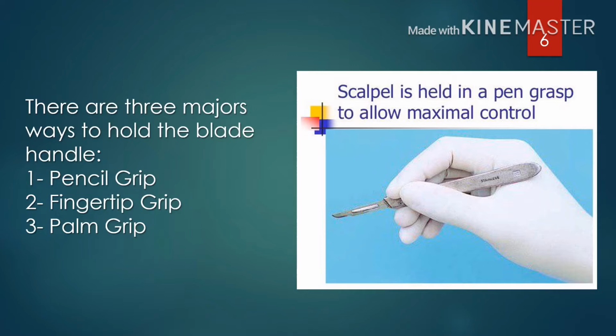There are 3 major ways to hold a scalpel. The first and most important one is the pencil grip, which most dentists use because it allows maximal control. We also have the fingertip grip and the palm grip, which are less common in use.